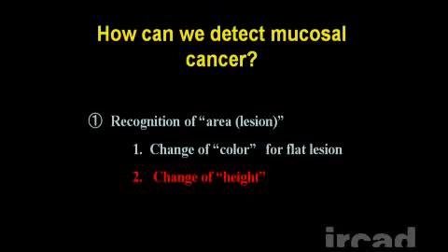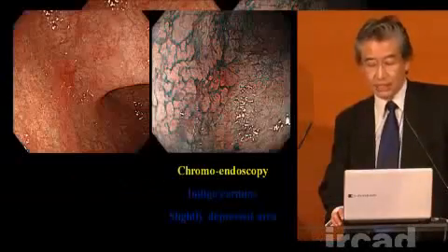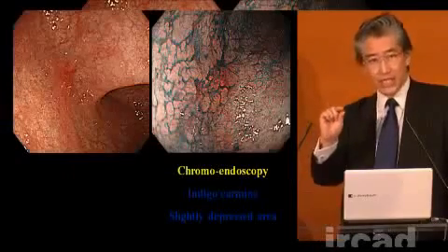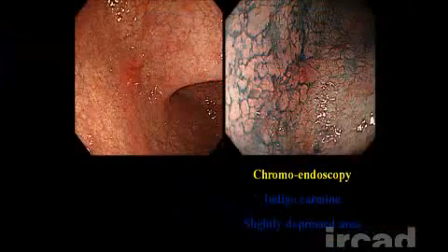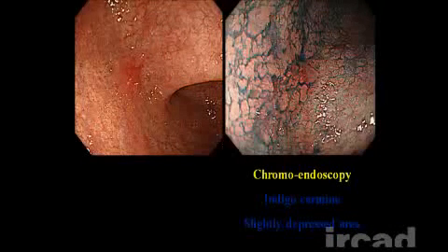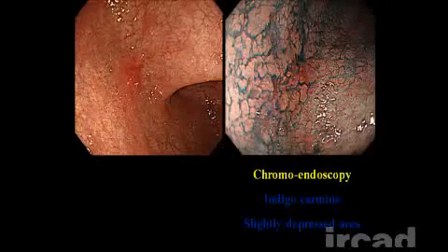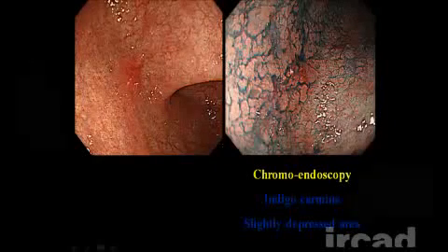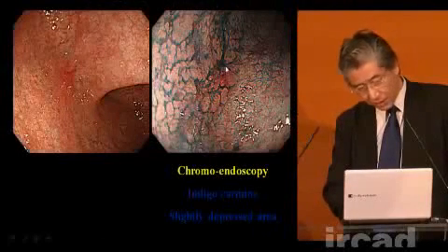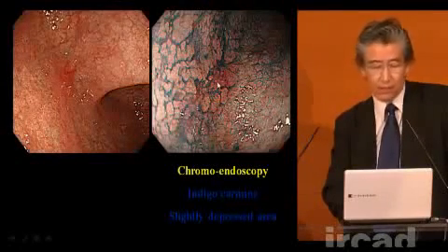So another key point, I mentioned the change of color is a key point to detect the lesion. And the another point is the minute change of the superficial height, I mean depression, slight depression or slight elevation. So now you can see on the left-hand side the white light image, a reddish color change on the mucosal surface. Now after spraying of indigo carmine, we can identify the slightly depressive change. We can identify the depressed area with some erosion.